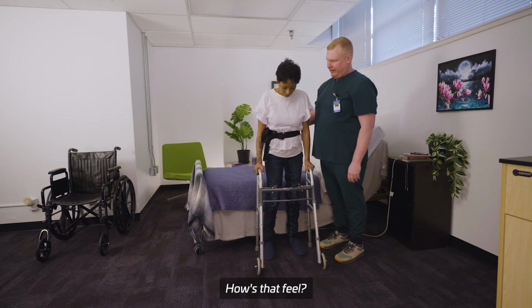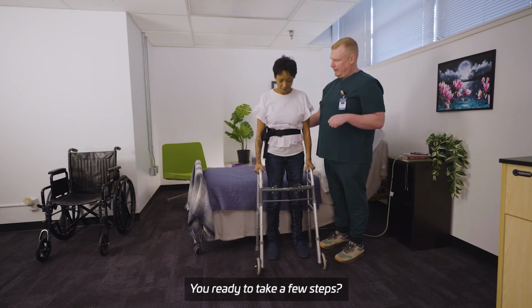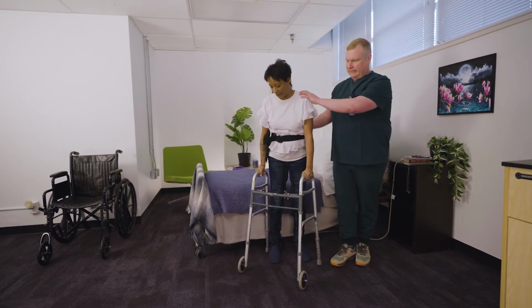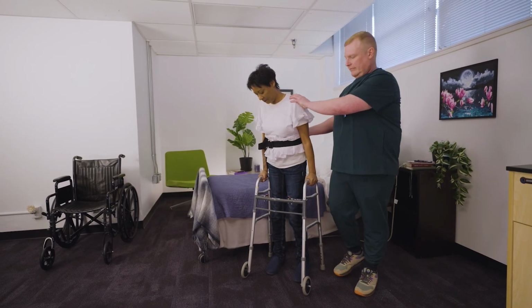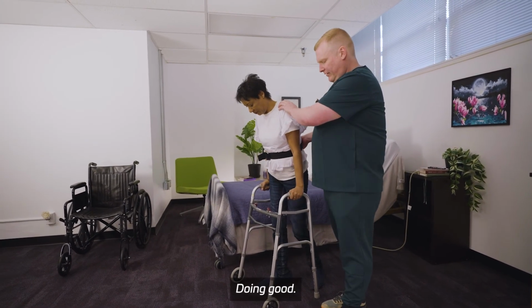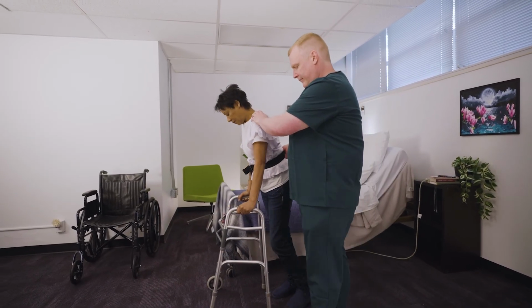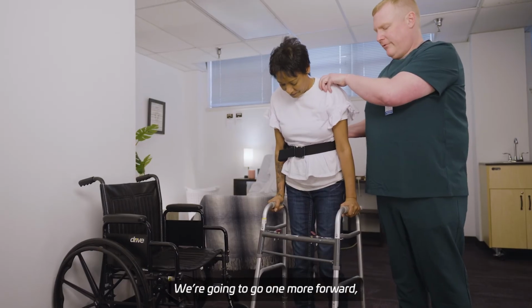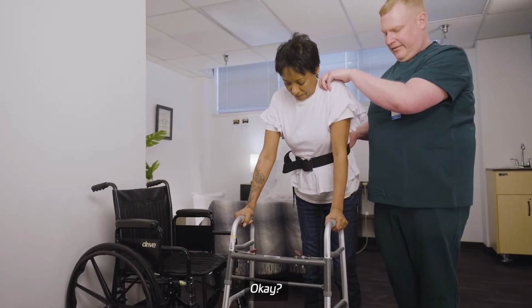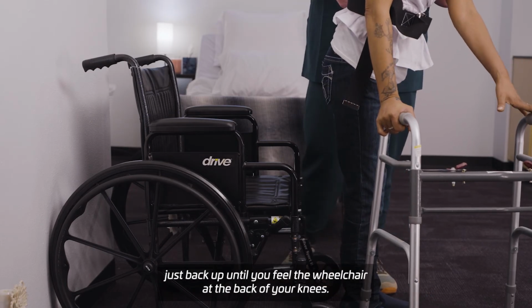How's that feel? Feels good. All right, you ready? Okay, cool. You ready to take a few steps? Okay. Okay, we're going to head over toward your wheelchair. Doing good. We're going to go one more forward, and then we're going to pivot and kind of back into our wheelchair, okay? And what I'd like you to do is back up until you feel the wheelchair at the back of your knees, okay?